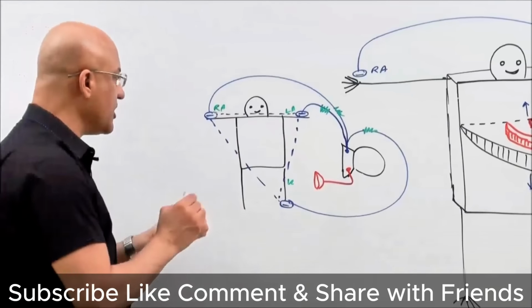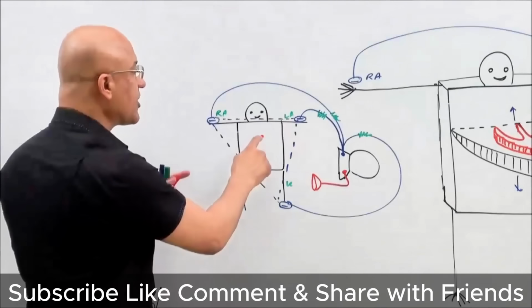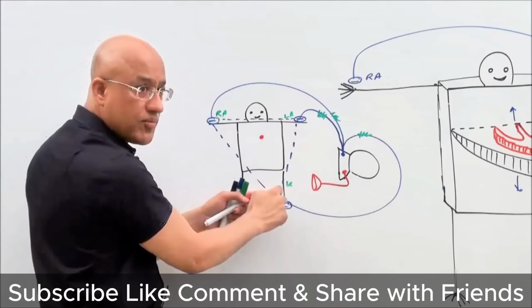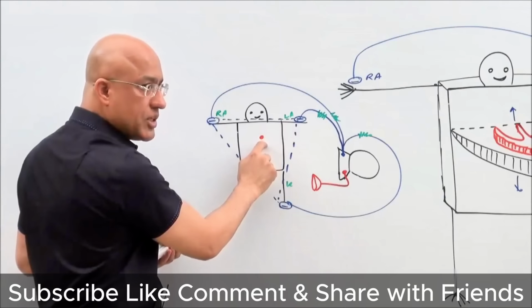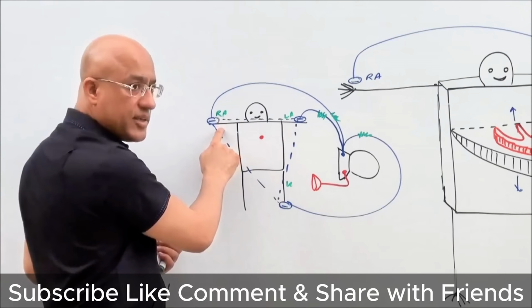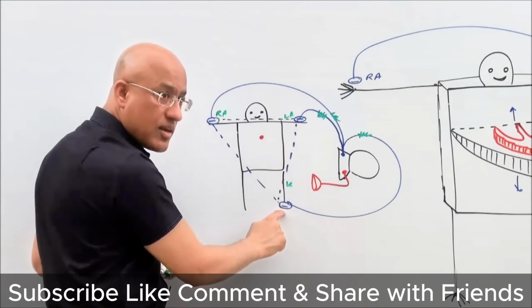For example, the heart is here and the heart is generating electrical activity. Now this electrical activity is transmitted along these parts. So the electrical activity produced by the heart at any moment will be detected by the right arm as well as the left arm as well as the left leg.